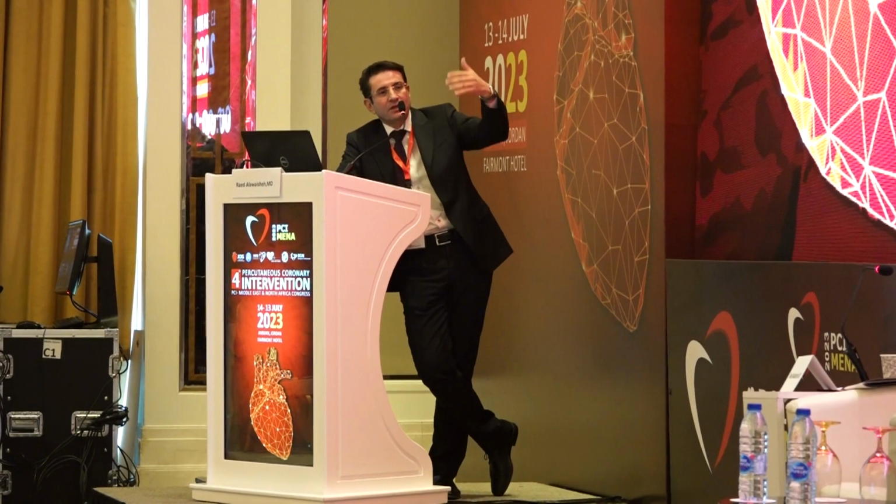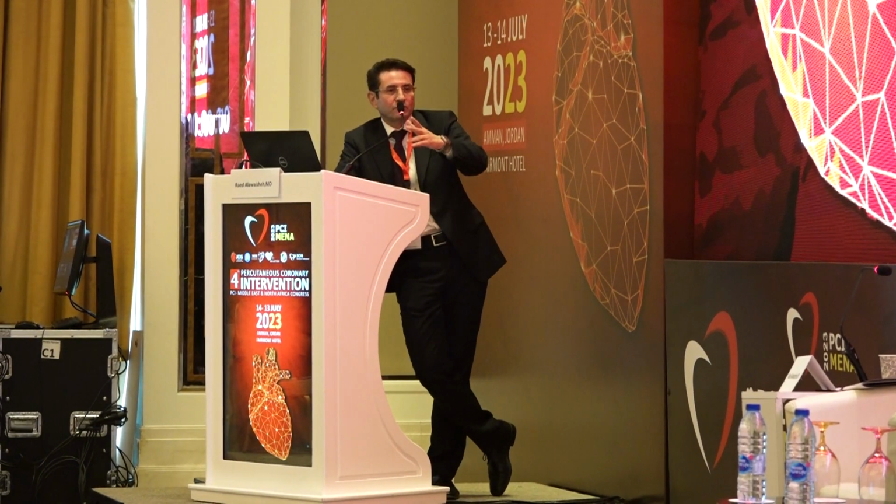Yeah. In this case, if you noticed, the segment which is really seen from the LAD is just at the apex. It's a very short segment. You cannot see the body of the LAD from antegrade or retrograde. Only from the epicardial collateral can you see the LAD. So that's why it was not sure. There is no septal connection between the RCA and the LAD. That's why I chose this epicardial collateral.